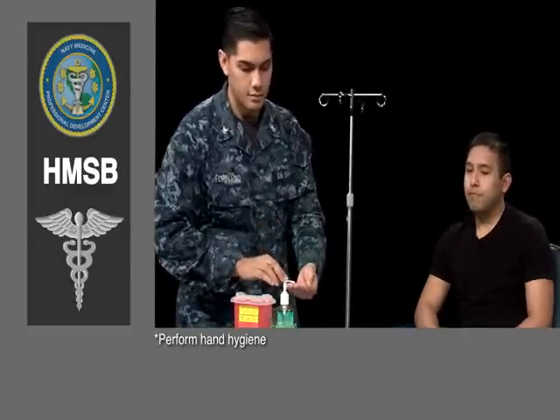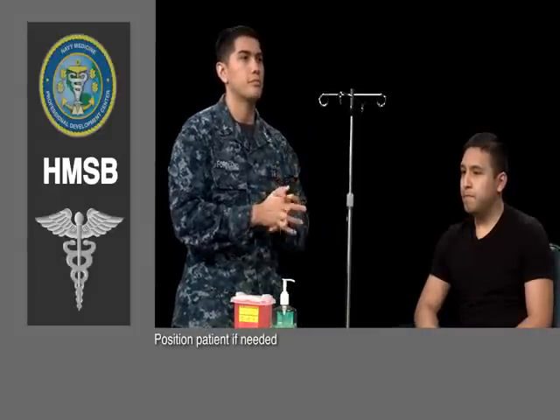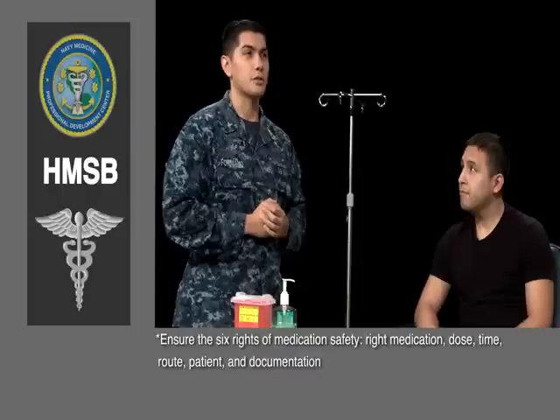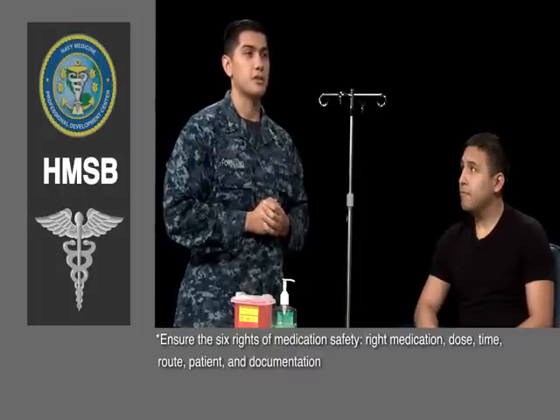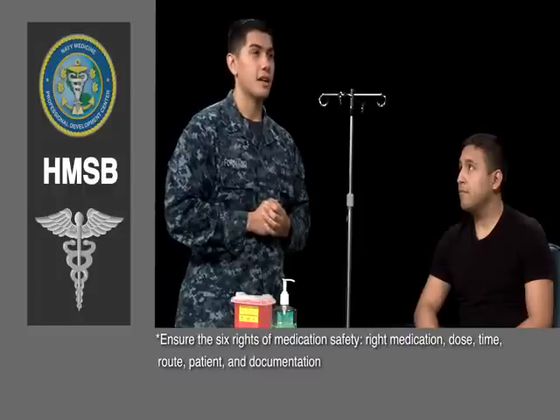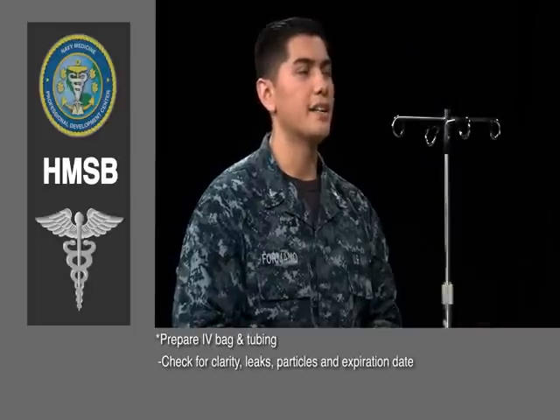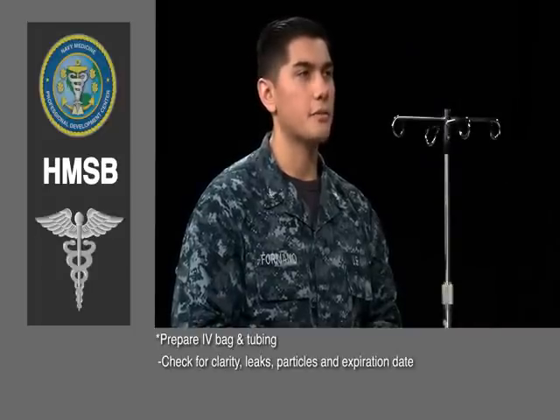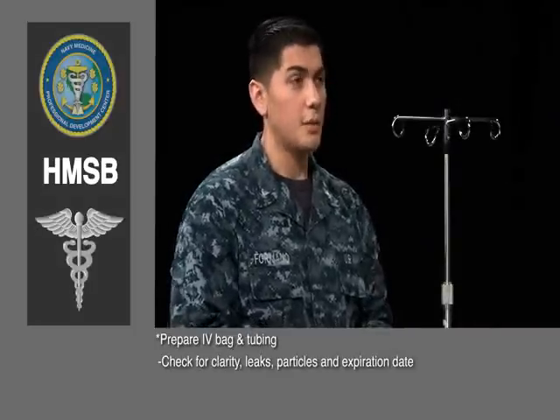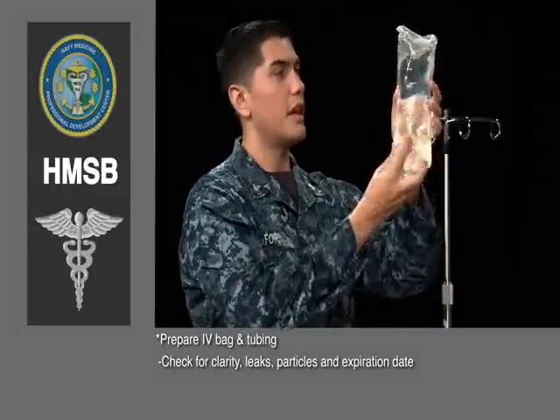Before going any further, I'll perform hand hygiene. Before we begin, I'm going to ensure the 6 rights of medication administration, which are the right medication, the right dose, the right time, the right route, the right patient, and the right documentation. Next, I need to prepare my IV bag and tubing. I'm going to be checking for clarity, any leaks or particles, and the expiration date.